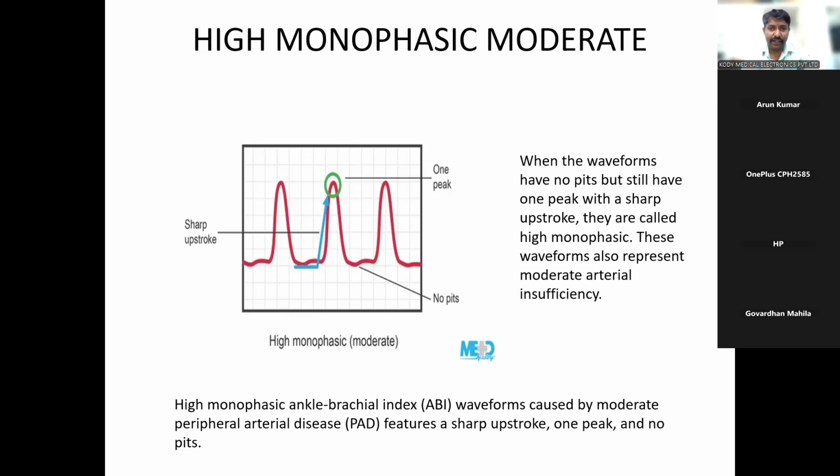So if we find out this critical information, the treatment plan itself will change. The doctor identifies the condition. Generally, when people diagnose a complication, they refer to a vascular surgeon, plastic surgeon or diabetic foot surgeon. They are only treating at the end stage, when the problem has matured, so there is no point. In the initial stage itself, they have to understand the level of the problem.